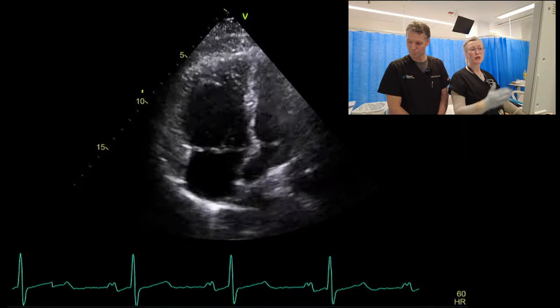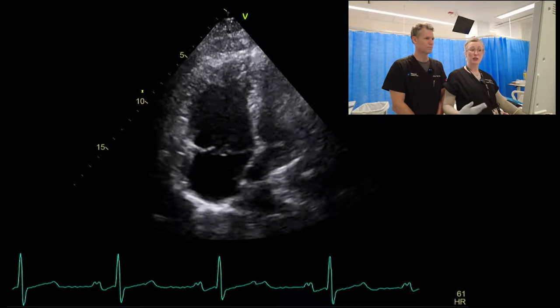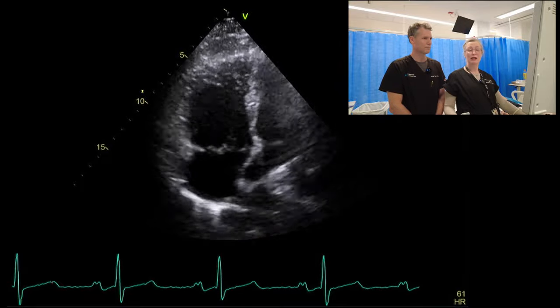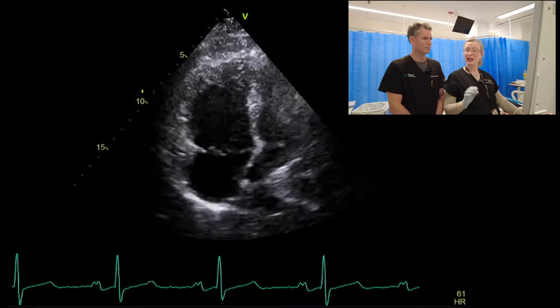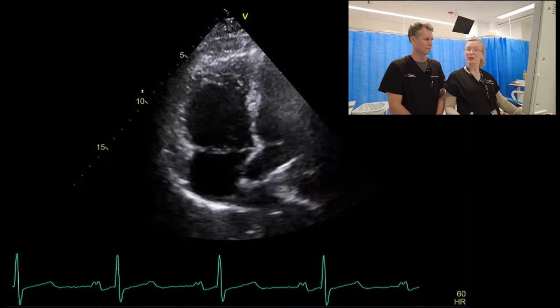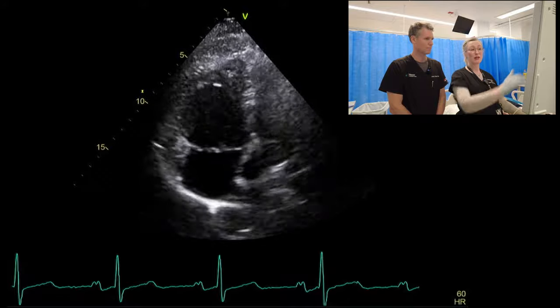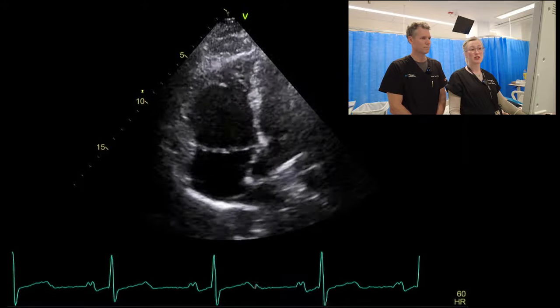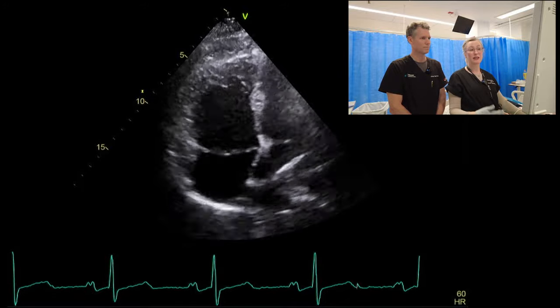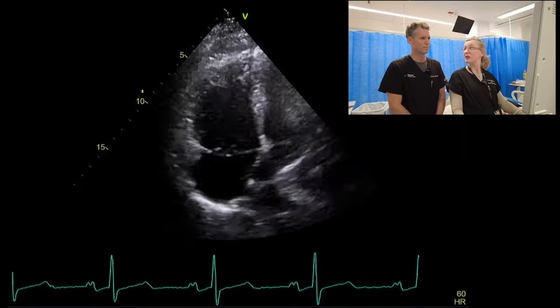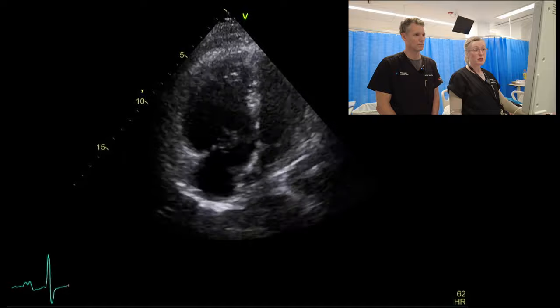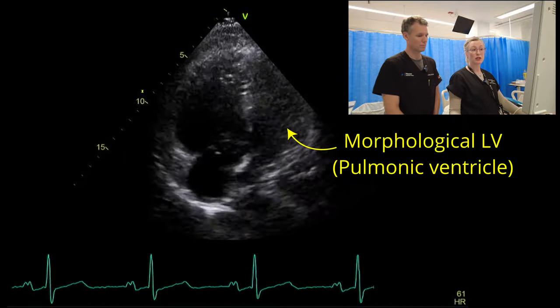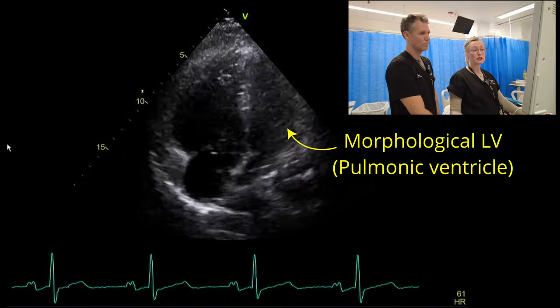A complication that we worry about with TGAs after an atrial switch is right ventricular dysfunction, and we can appreciate just by visually inspecting that it looks so. This is our pulmonic ventricle — the morphological left ventricle.